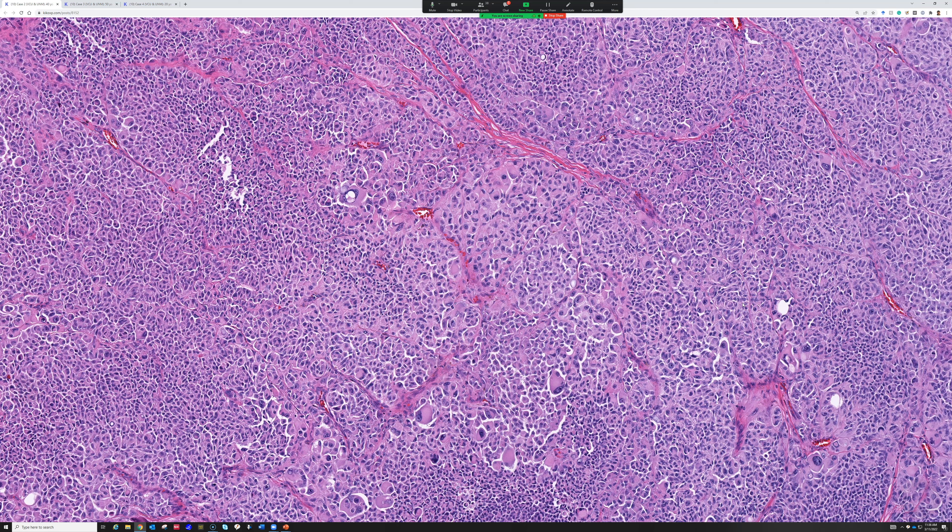Big bulky melanoma metastases like this often begin to de-differentiate and lose melanocytic marker expression, either partially or completely. A big ugly epithelioid melanoma will usually have some MART1 left somewhere, but it can have large zones of loss. On a core needle biopsy, MART1 can be totally negative — and especially in spindle melanoma, I see that all the time.